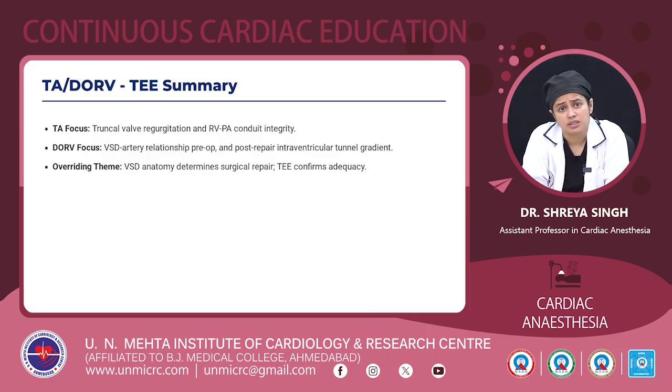To summarize, in truncus arteriosus or DORV, we look for truncal valve regurgitation and RVPA conduit integrity. The VSD artery relationship should be described pre-op, and post-repair, the intraventricular tunnel gradient should be seen. And the VSD anatomy determines the surgical repair, and TEE helps in confirmation of its adequacy.